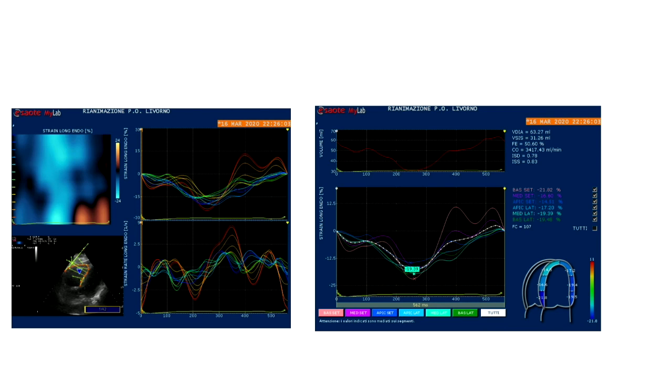Okay, when we did the levosimendan, if you do the strain of the right heart function, the strain remains low. It seems that the right heart function recovered completely, but the strain remained low. And after 1 week, we had again, in the next slide, an enlargement of... please, the next slide.